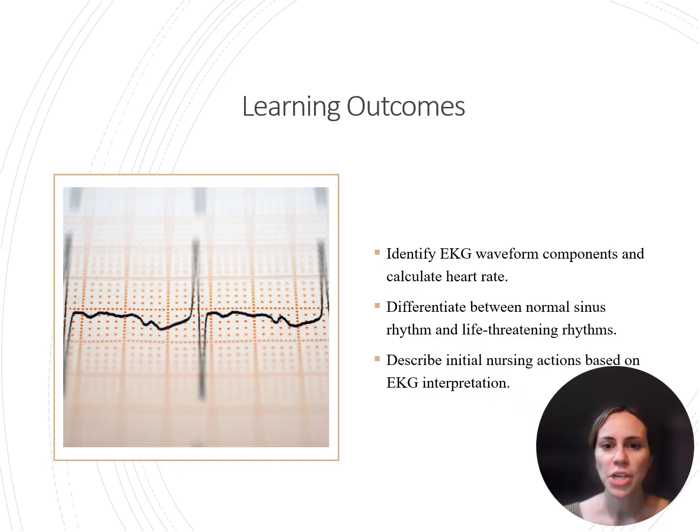By the end of this session, I hope that we can accomplish three things. We can be more competent in identifying EKG waveform components and calculating heart rate. We can differentiate between normal sinus rhythm and a few life-threatening rhythms. And lastly, we can describe initial nursing actions based on EKG interpretation.